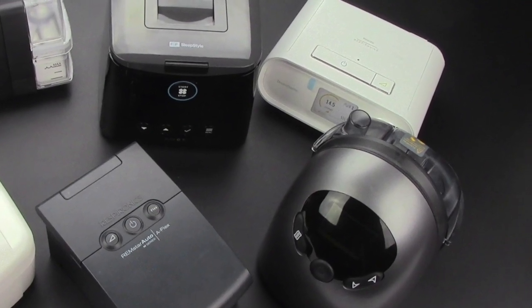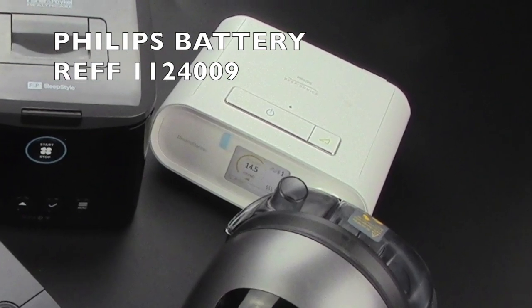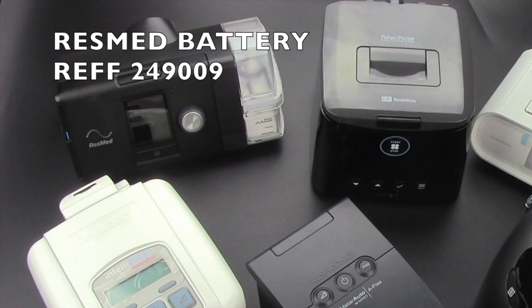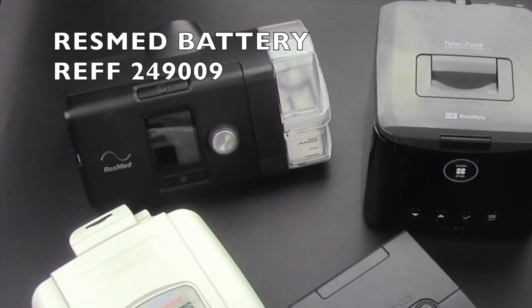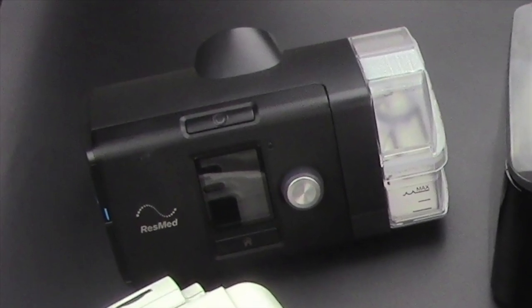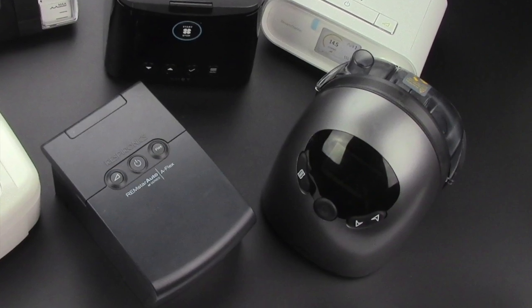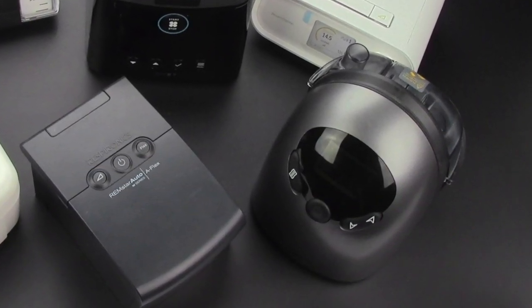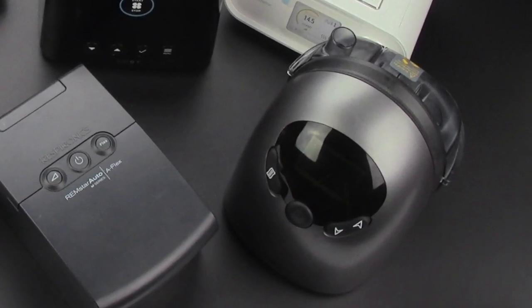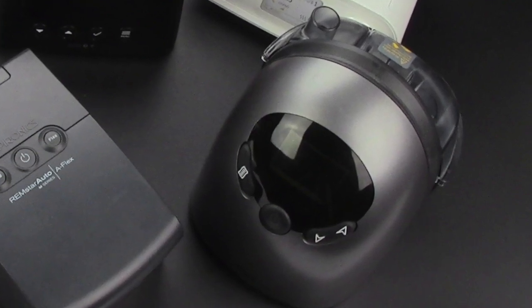With that being said, almost every other CPAP manufacturer will have their own battery pack, or there will be a third-party battery option as well. They'll just plug straight into your machine. Some machines will even have a dedicated DC in port. Examples of that would be the S8 by ResMed and the ICH2 by Apex. They'll have a dedicated DC port that you can just plug into.